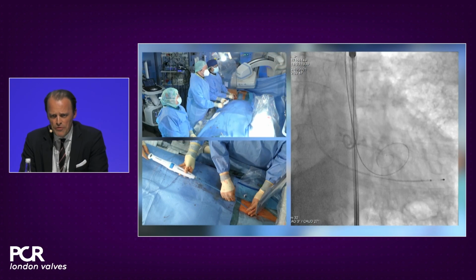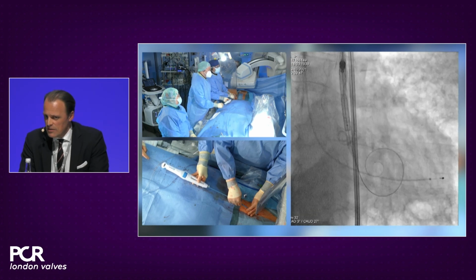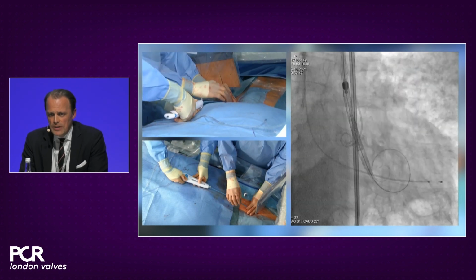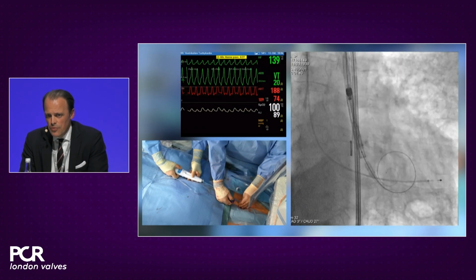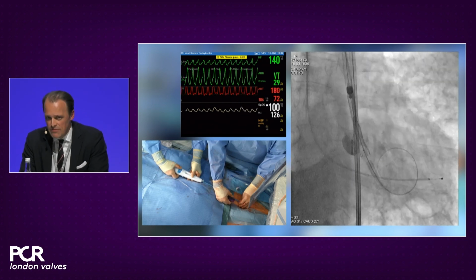Now, before entering into the annulus, I like to switch to the cusp overlap view in order not to have the valve stick in the annulus overly long when maneuvering the C-arm. And then from now on, I will show the hemodynamics in just a second. I think this is really exceptional, the kind of hemodynamic stability that you generate with this valve.